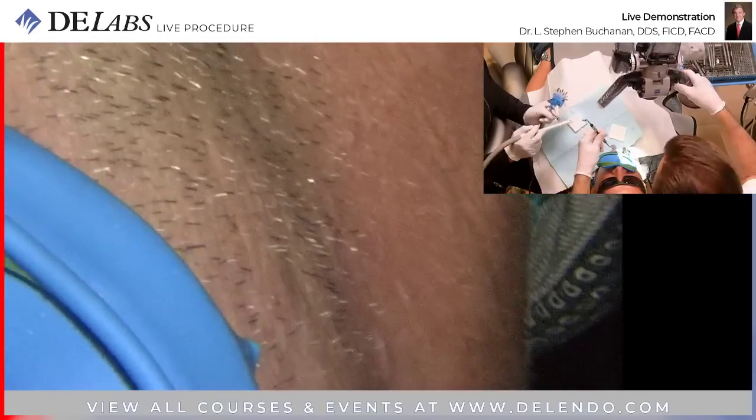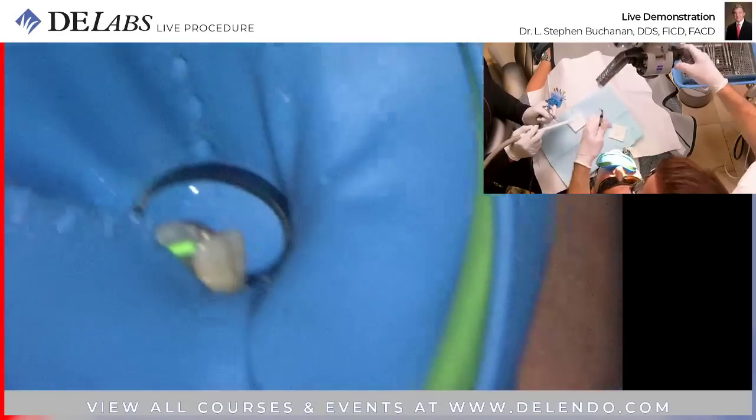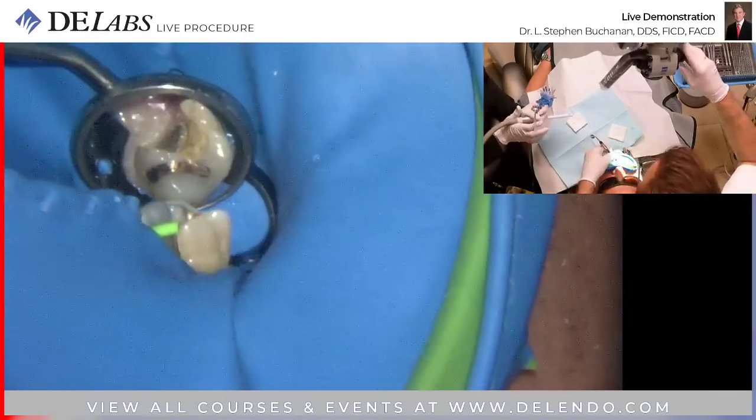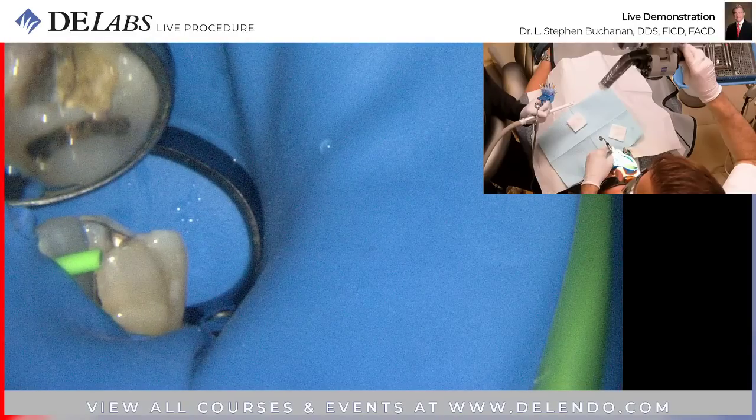Somebody move the microscope. That's a bad idea. Let's move the rubber dam clamp a little bit. We're on soft tissue.